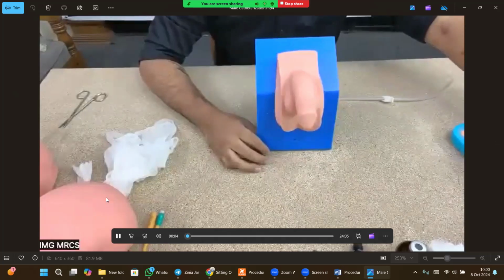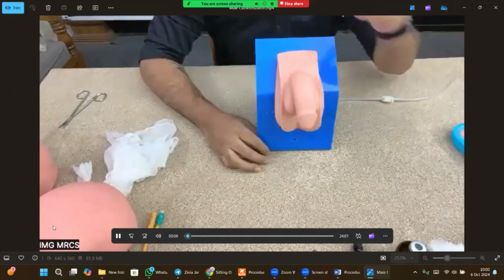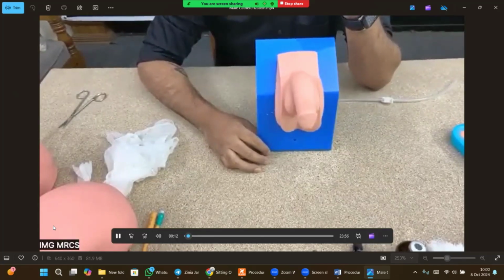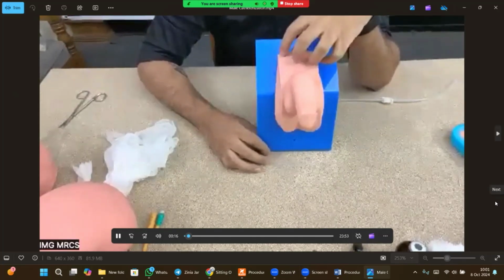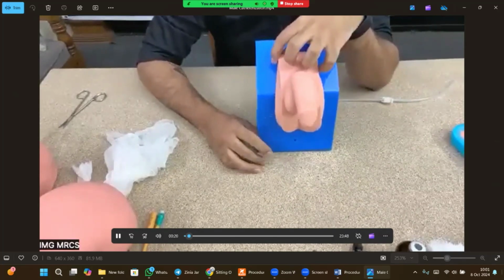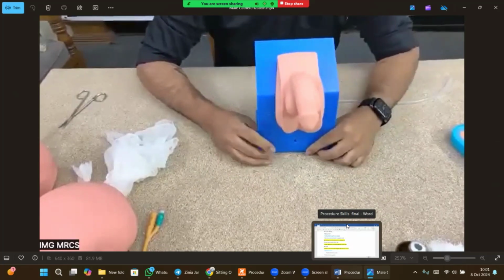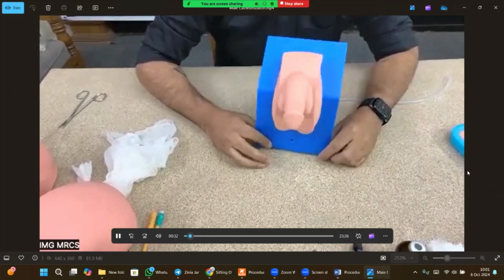Okay, for the male catheterization station, what you're going to have as a stem is, in your hospital, a 50 years old male came and the patient is having acute retention of urine, and you are a surgical SHO attending the patient. Now the patient is requiring a Foley's catheterization, all right? So here, again, we have to follow the 10 steps approach for the procedural skills, okay?